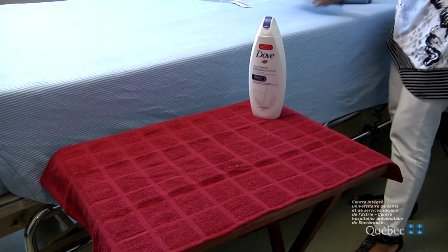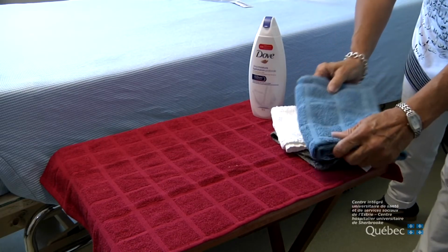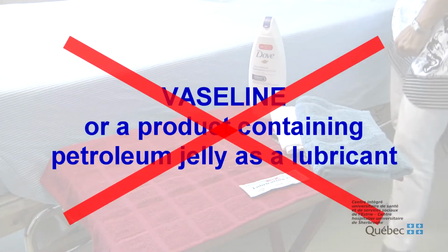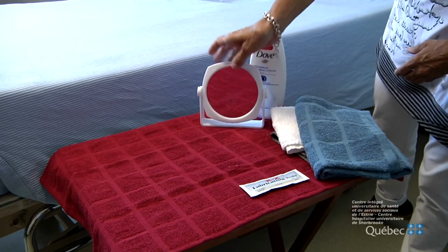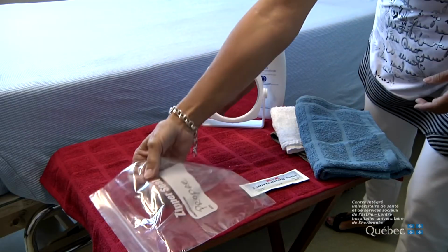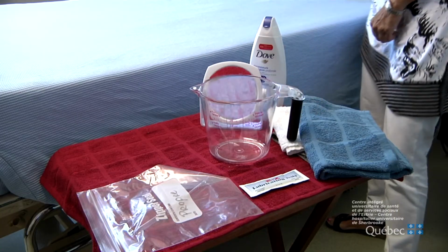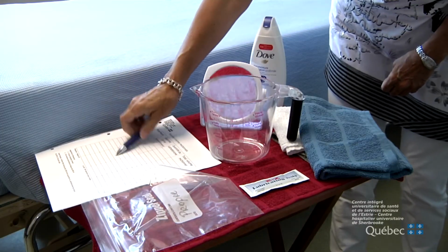To perform this procedure, it is important to choose a spot with enough space to place the following materials on a towel: liquid soap, 2 washcloths, a clean hand towel that has not been used, water-soluble lubricant. Remember that the lubricant cannot be Vaseline or a product containing petroleum jelly, mirror, urinary catheter, the other unused measuring cup for collecting your urine, pencil and paper for recording the volume of urine.